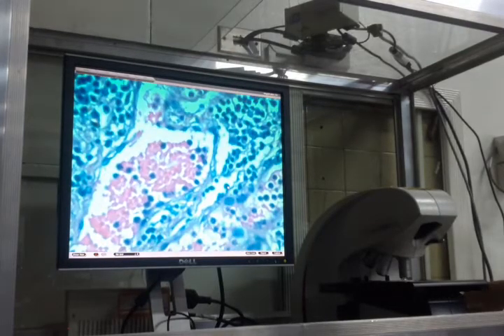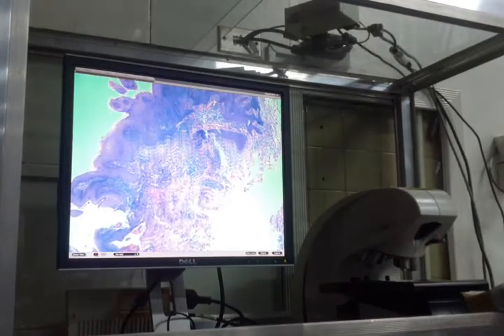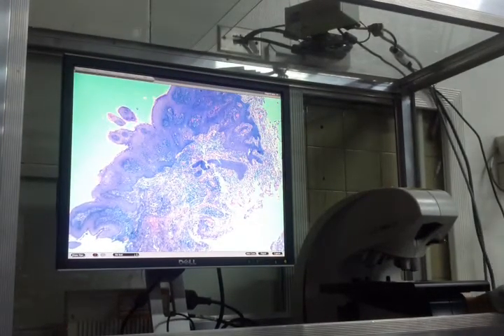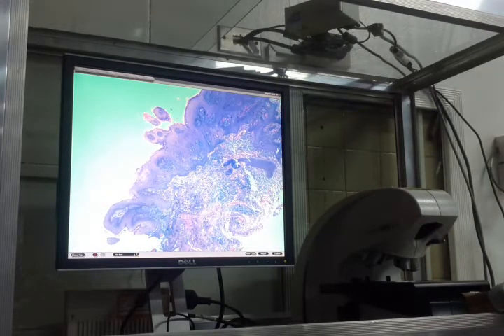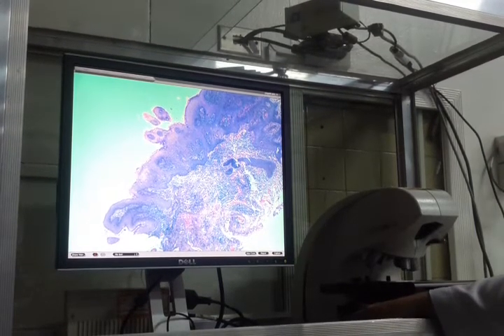Slide number 4. Doon tayo sa mababa. Okay. This can also be given in neoplasia. This is a section of the skin. Tama? Section of the skin, ang lining epithelium mo, stratified squamous epithelium which is keratinizing, like what you have here.